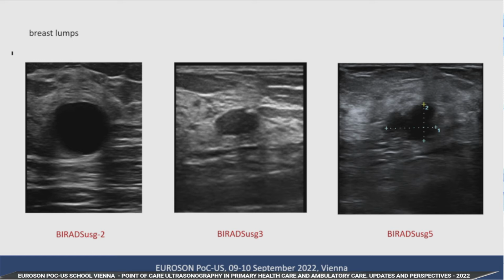So dealing with breast problems, on one hand there is sonographic focused examination, where we focus on a tumor that we feel in our patient, and based on the examination we choose the right diagnostic way. Or the other is a full examination of the breast, and it's better in people who are not considering any lesions, like prophylaxis, or looking for something which is not clinically palpable.